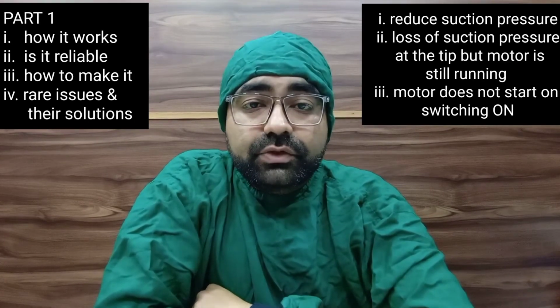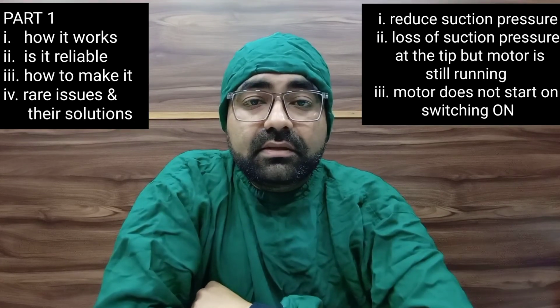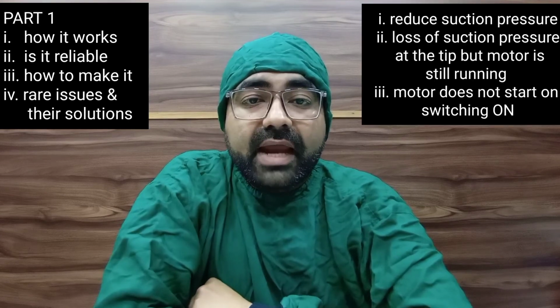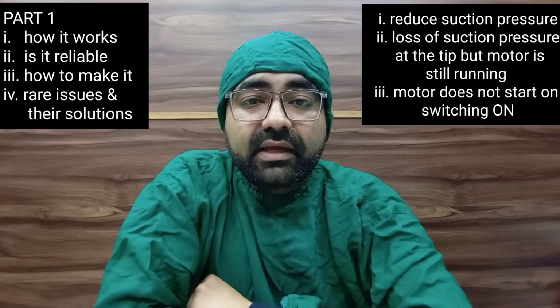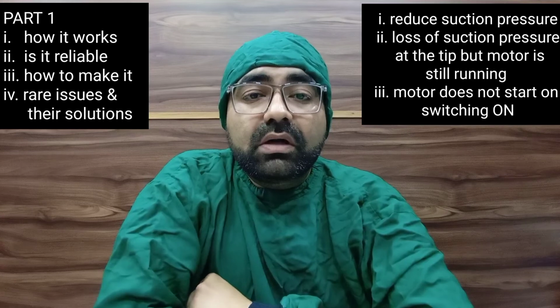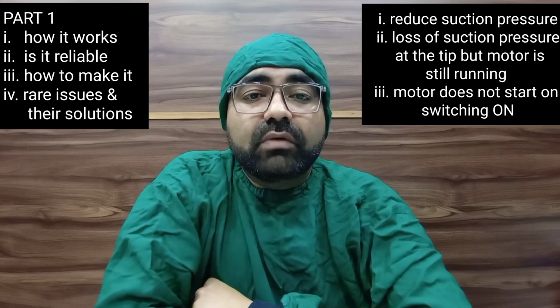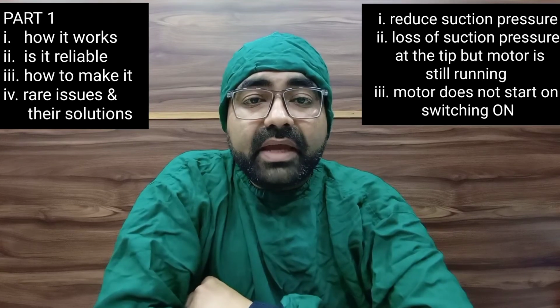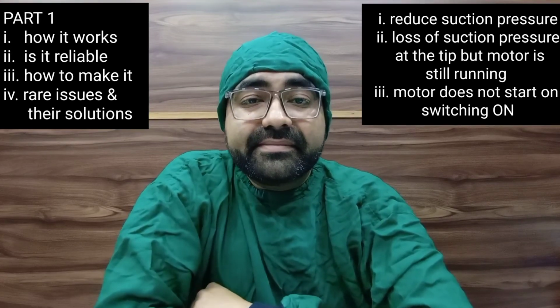To avoid this issue, instruct your assistant to do suction with 1 bucket of fresh water at the end of each working day, and this will clean out all the residue and bloody clots from the motor core, and it will also clean out your drainage pipe and your clinic's drainage line.